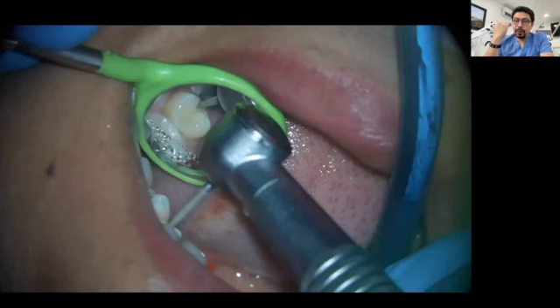The microscope will become an extension of your eyes. So the microscope should be directed to the mirror. So the first thing that you need to detect is, okay, I will position the mirror here, and the microscope will go to the mirror when you need to use it. Because I already explained to you that with the 3D microscope, you can have direct vision almost all the time.